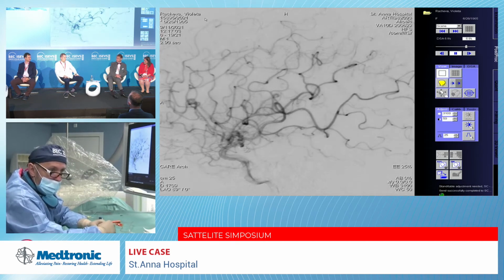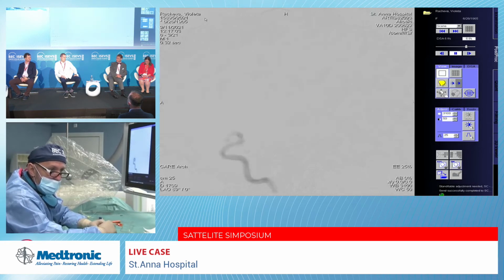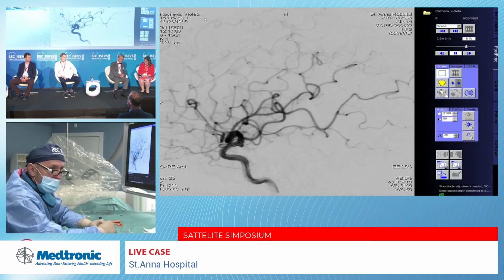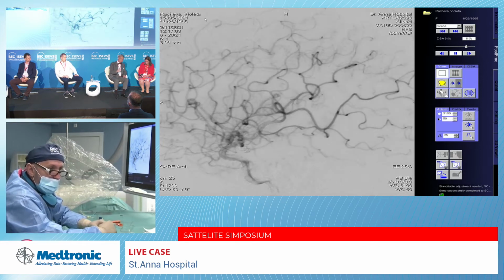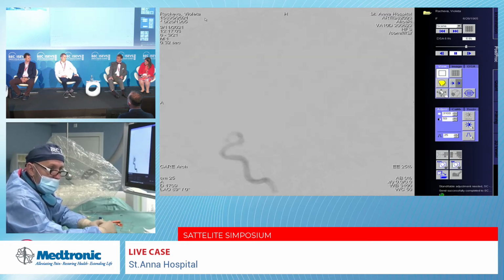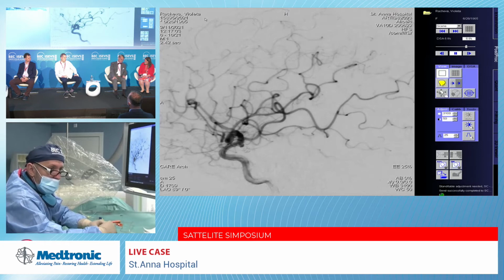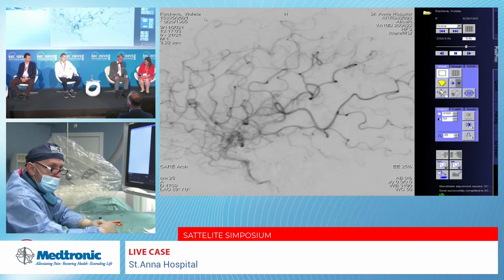We still stick to 6 months dual antiplatelet and 1 year for mono. We leave it just for the aspirin. But after we started to put this new coating of the Phenox stents, the hydrophilic coating, we have several patients on monotherapy from the beginning. We stick to them only with prasugrel, 10 milligrams per day.